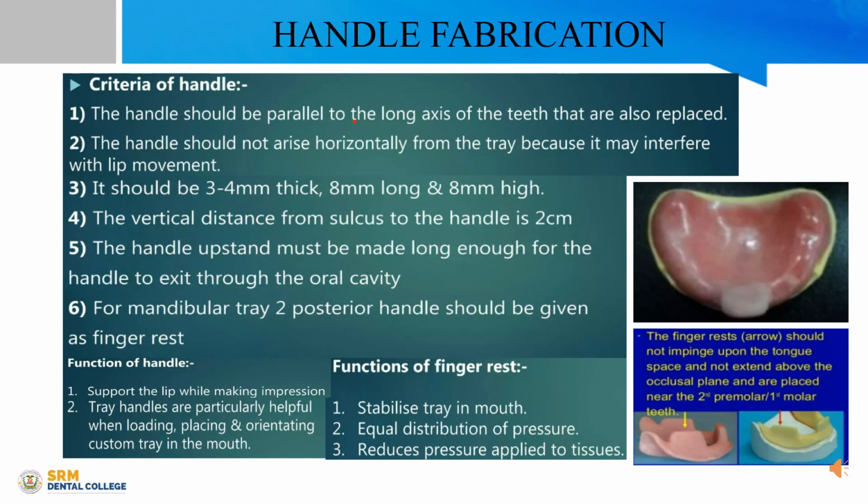Functions of the finger rest: it stabilizes the tray in the mouth, equally distributes the pressure, and reduces the pressure applied to the tissues.